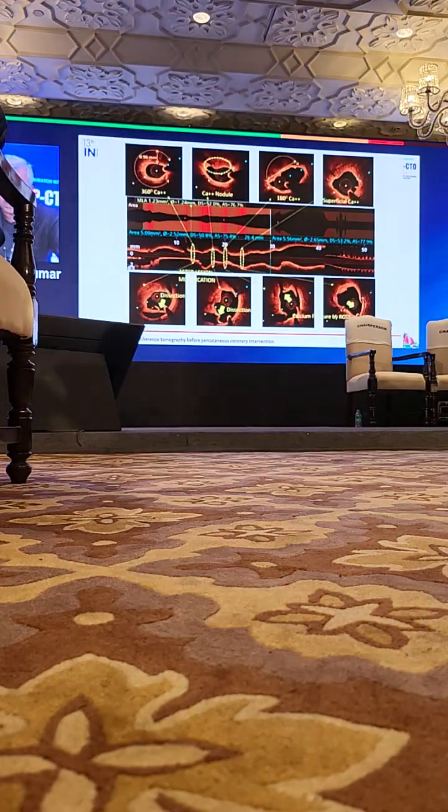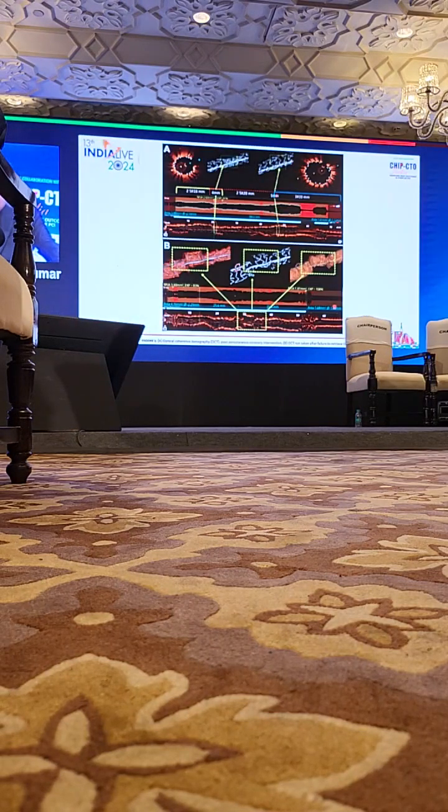If your OCT catheter is stuck, you are in trouble. This is an OCT catheter. We showed you excellent images. You can see all the images. The calcium was done by rota. When we went inside, you see the top one. We got excellent images, and we were greedy. So it was a metal jacketed LAD. We went right through the tip of the stent. The wire got dislodged. The stent got caught, and just see how badly the whole thing got damaged. We couldn't even reach the table.